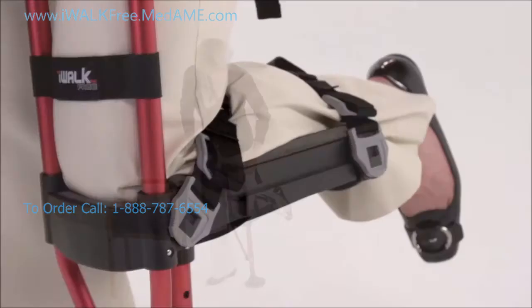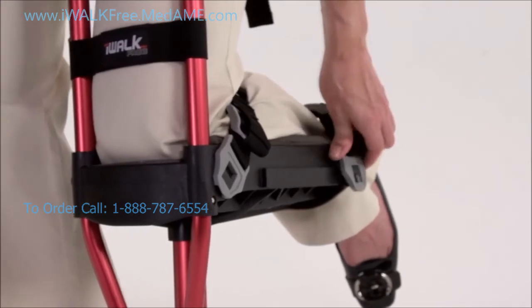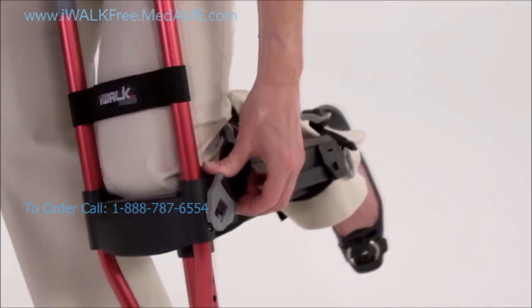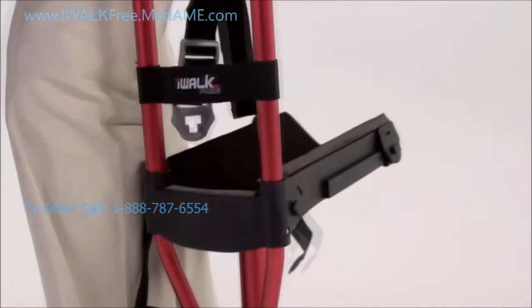To take your iWalk off, just pull apart the velcro, then release the tension by lifting the front of the grey tension lock, then remove the T-lock buckle. As you can see, getting in and out of the iWalk is really quick and easy.